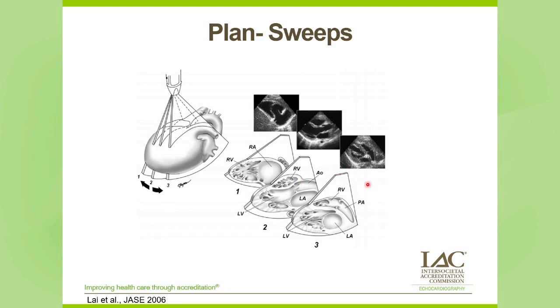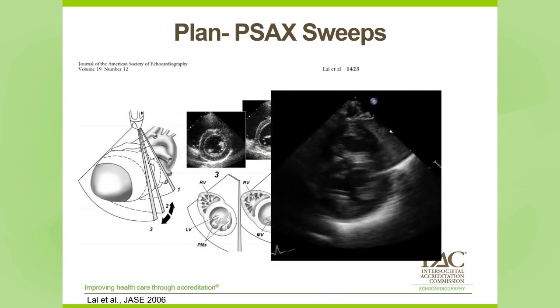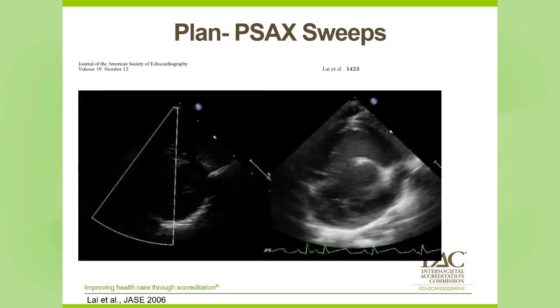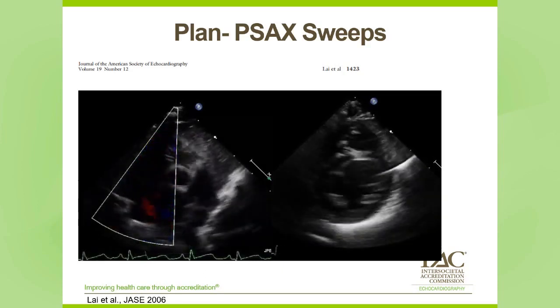Sweeps are an essential part of congenital imaging. Think of a sweep as a complete motion from side to side, anterior to posterior, or superior to inferior. It shows us what is going on in between the typical slices we normally obtain. In the parasternal short axis view, we have a typical left ventricle, mitral valve, and a slice at the base. This is an example of a 2D sweep, starting near the apex and sweeping all the way up to the base. We also perform the same sweep with color Doppler, sweeping the interventricular septum — noting a little VSD there in red.